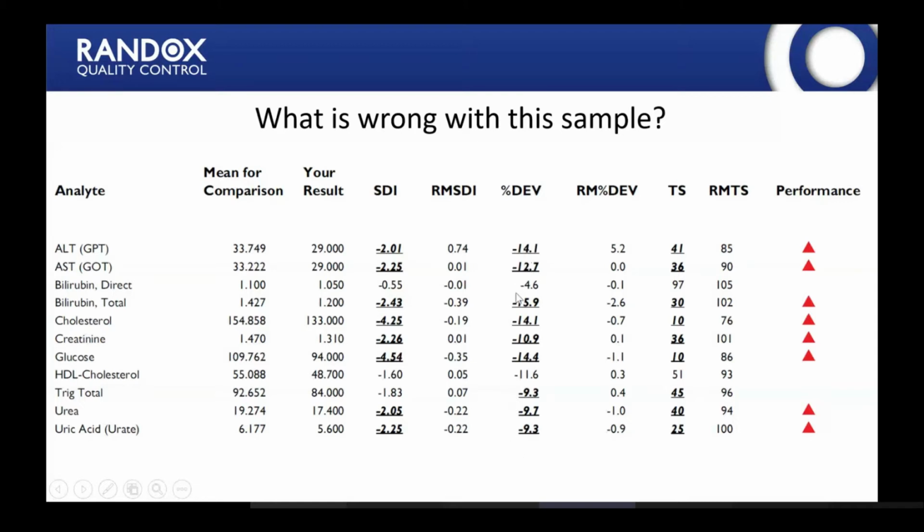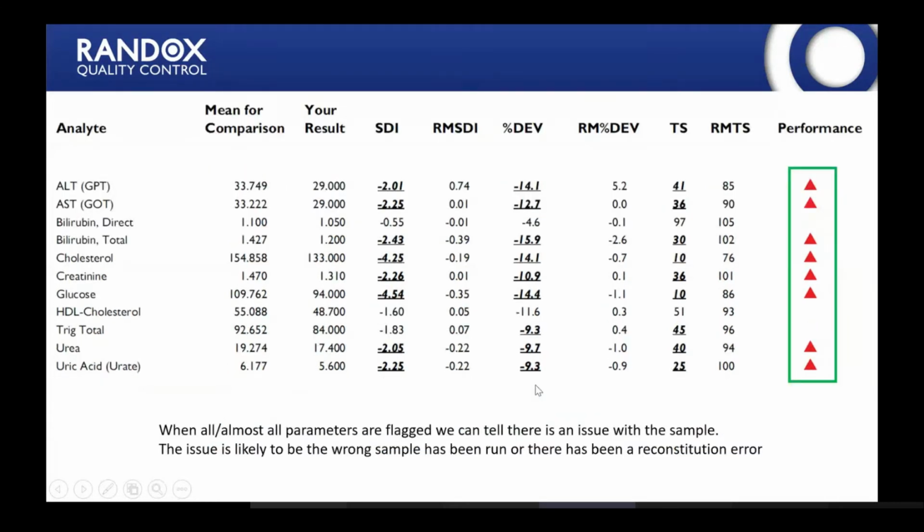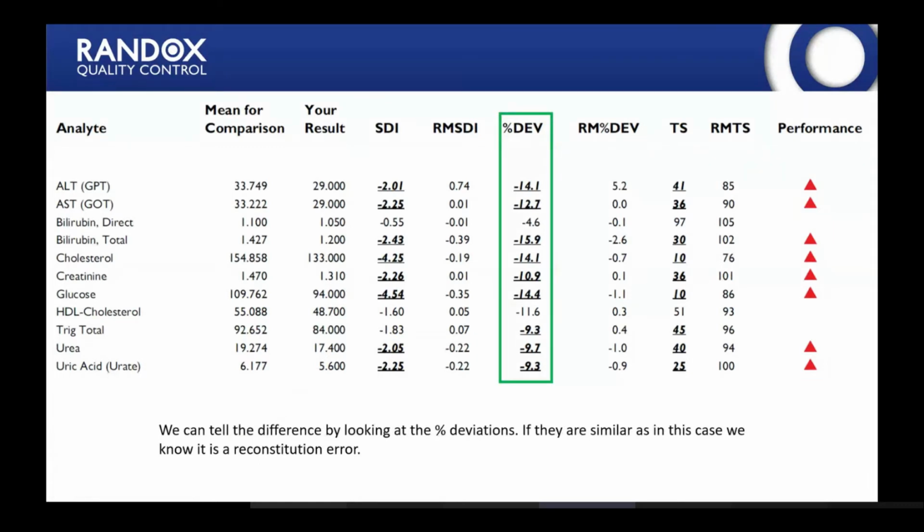So if all the percentage deviations are of a similar value and they're all below the mean or above the mean, then you know it's a reconstitution error. In this instance, the lab have under-recovered for all the different analytes, so we can assess that this is a reconstitution error that the lab has made.